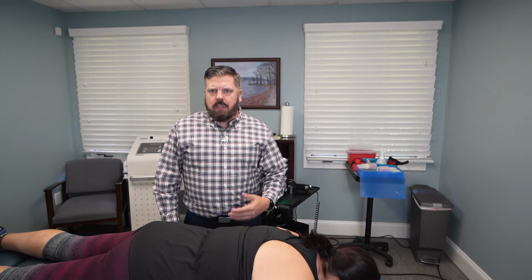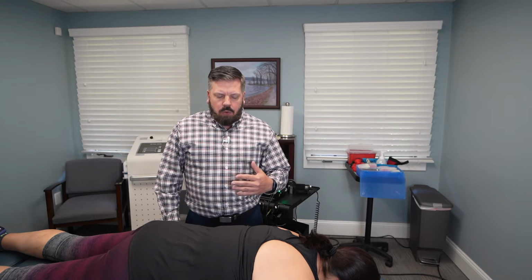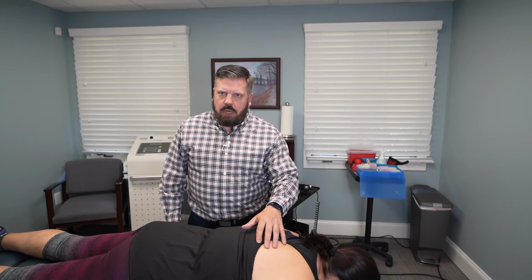The problem with shingles, it's a very difficult condition to treat. One of the treatments we use in our office is called laser therapy. So what the laser is going to do, it's going to penetrate deep into this area to help calm down that irritation that the shingles provides, and that is what causes the pain. So what I'm going to do is I'm going to demonstrate what laser therapy looks like when we're treating shingles.